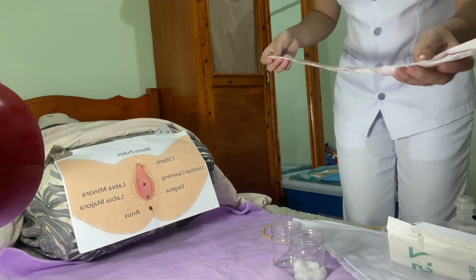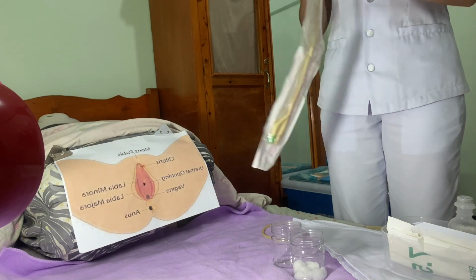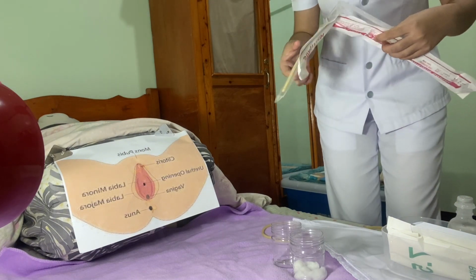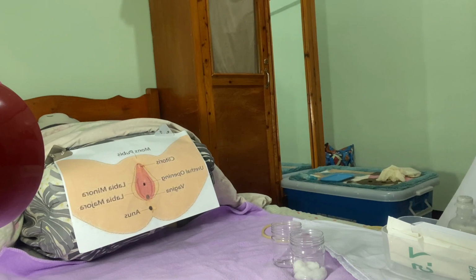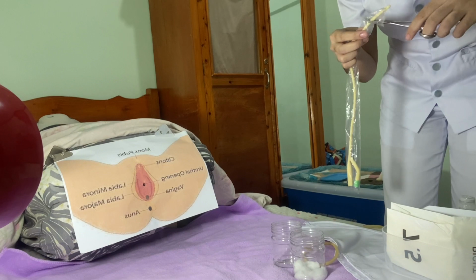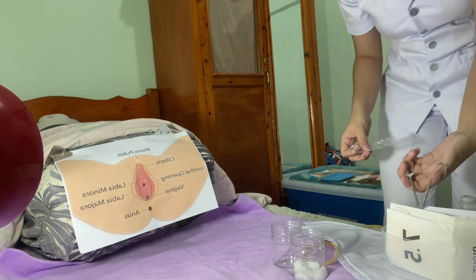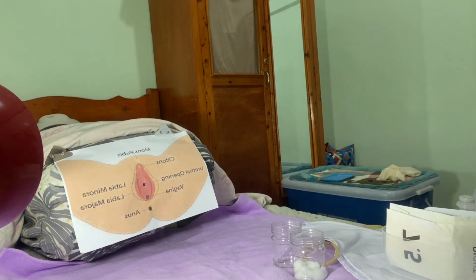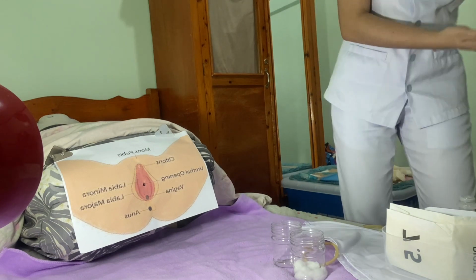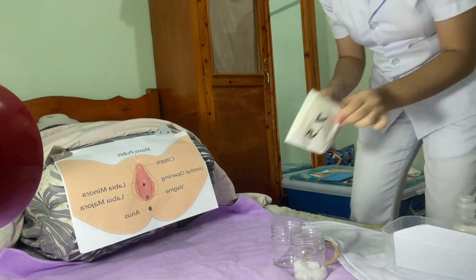So now I am going to add my catheter into my tray set. So I'm gonna open this one. And we have to discard this in a receptacle. So now I'm gonna use my sterile forceps and add this catheter to the catheterization set. And we're gonna discard this, and we have to perform hand hygiene. And we're gonna wear our sterile gloves.